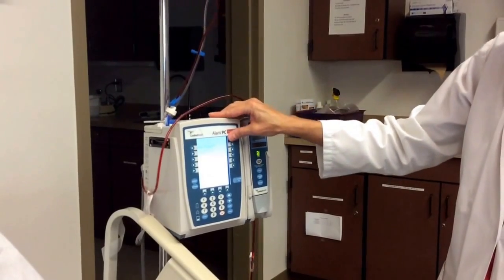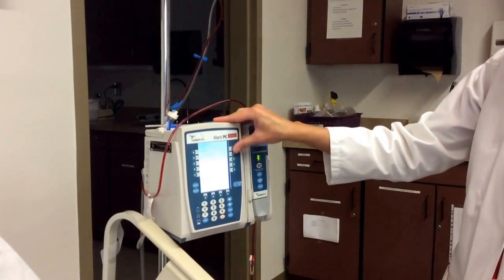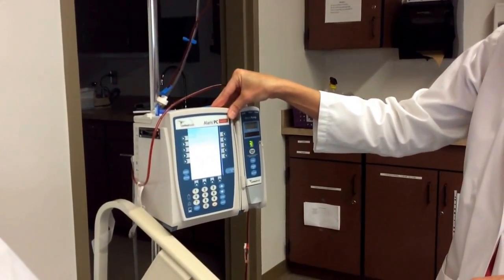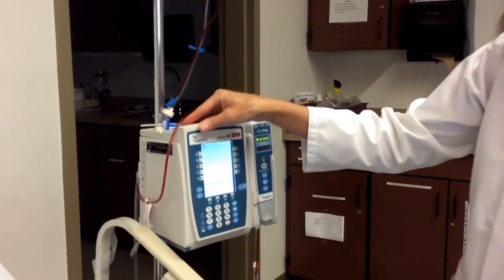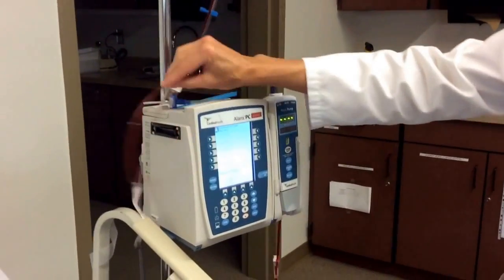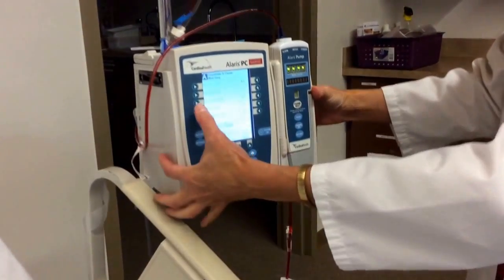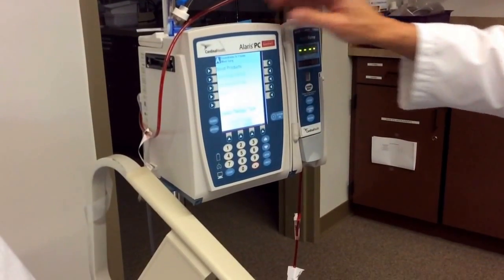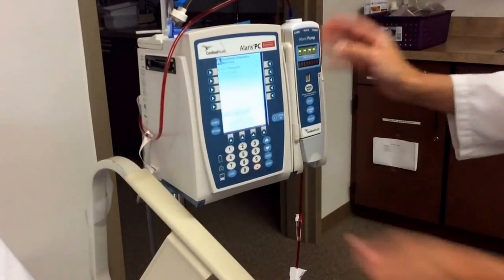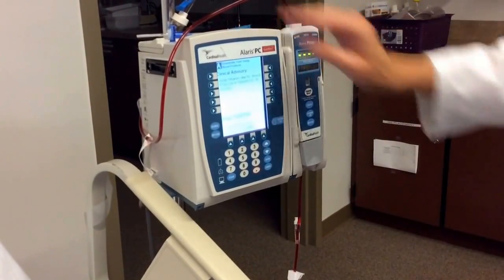Mr. Smith was just admitted, so he is a new patient. He is on the medical surgical unit. And I'm going to choose under Guardrail IV fluids. I'm choosing blood products. And in this case, he is receiving packed red blood cells. Okay.